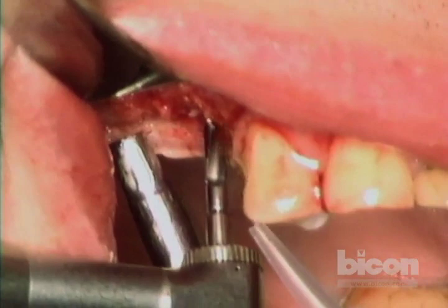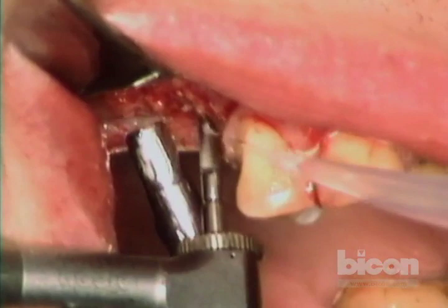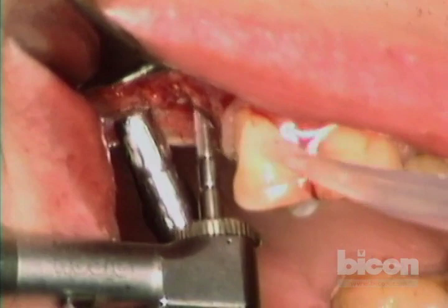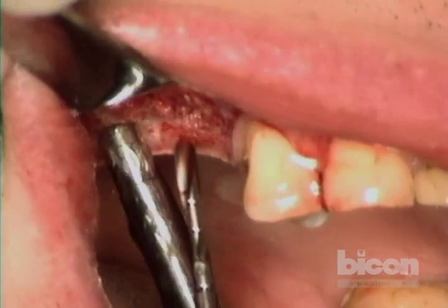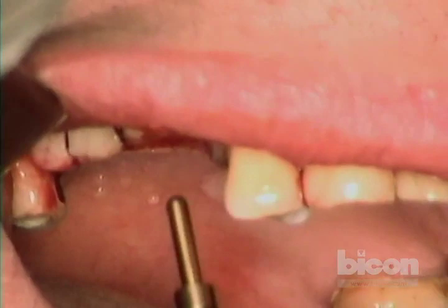I'm feeling resistance and I'm almost at eight millimeters — just at eight. I've now just lost resistance, and there was a bit of a step, so we double-check our position. Every time you use the pilot hole you can change it, but it's still unchanged. We'll now switch the handpiece and step back; I won't ream beyond about seven millimeters.